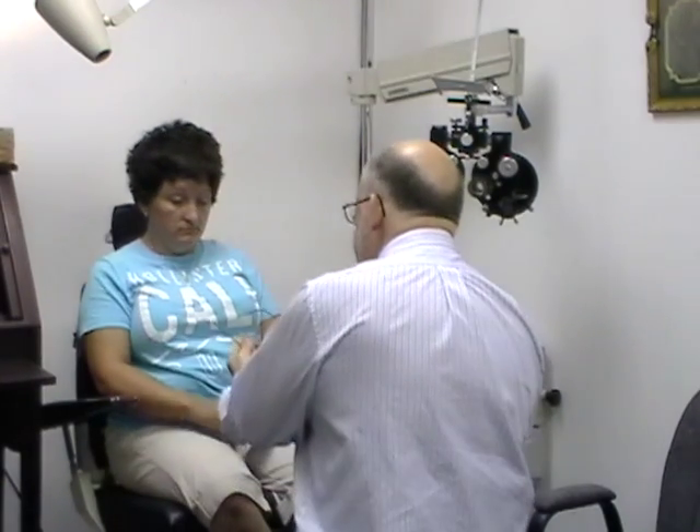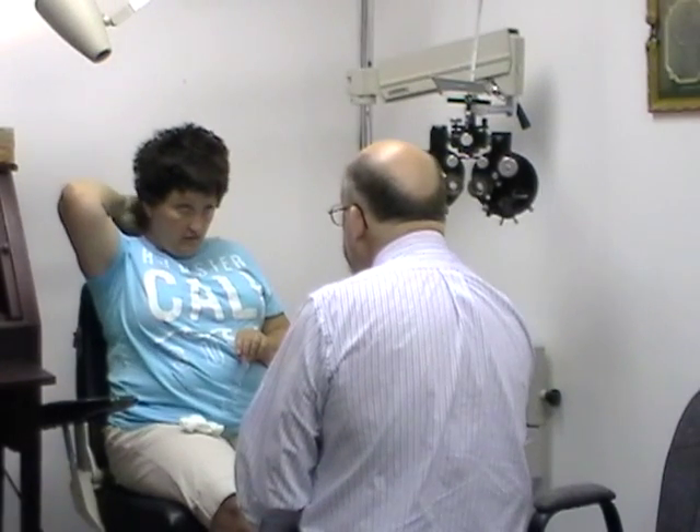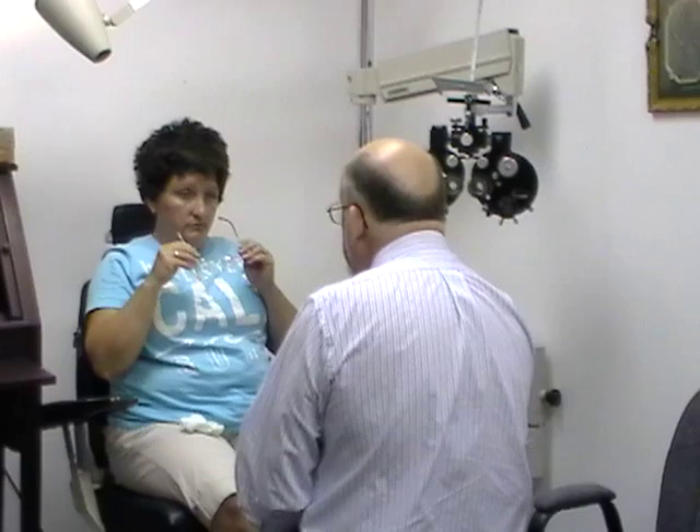Don, would you put the microprism lenses on and let's see if there's a difference? One thing I've had problems with — with the convergence exercises — when I do that and I move my neck back like that, my pain goes up the back of my head. Try it; why don't you try doing what you just did, but now with the glasses?